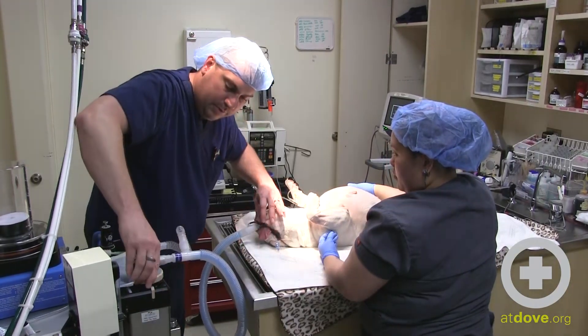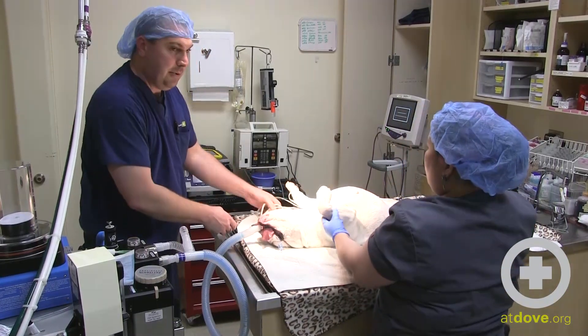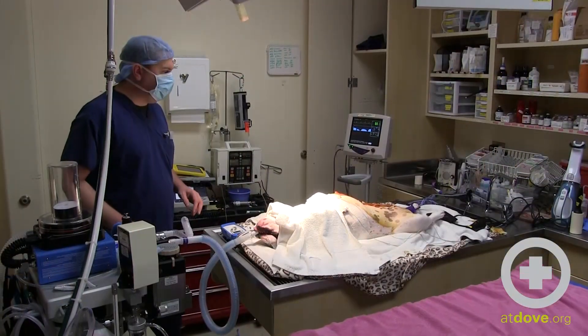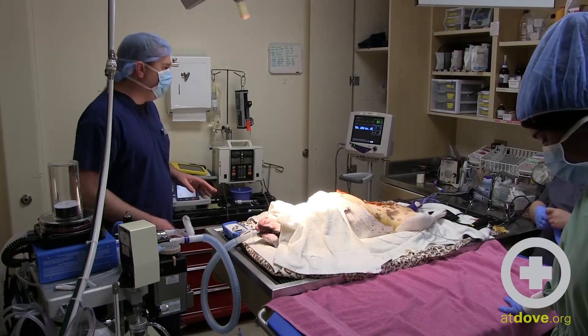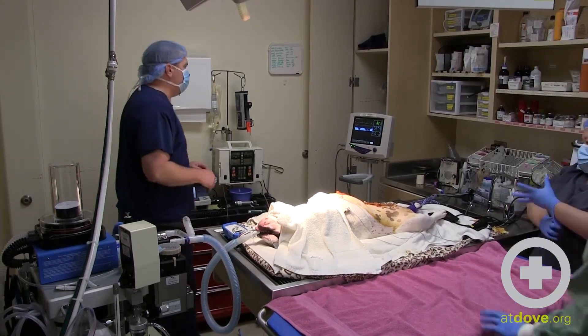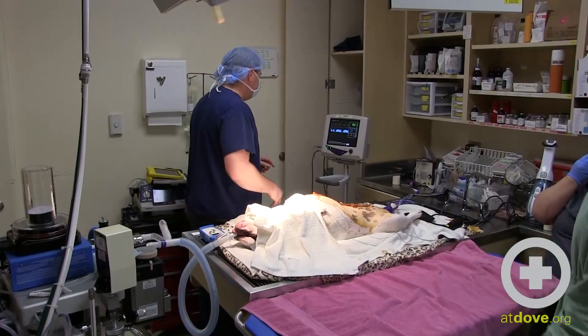The patient has been prepped and we're ready to move into the surgery suite. I'm going to work backwards from disconnecting from my monitoring equipment and my fluid pumps.